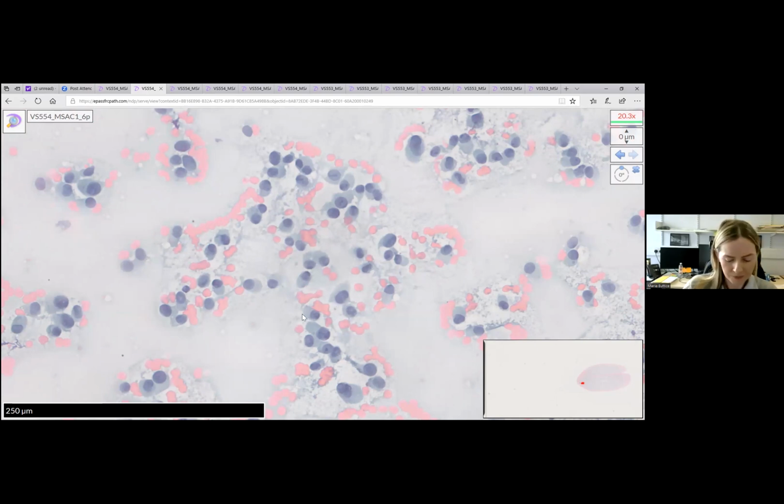Any questions? Thanks, Maria. I would just like to say that in this case, those of you who have gone straight for melanoma are probably going to get the best mark, because although melanoma can look like anything, this is what it most commonly looks like: a plasmacytoid, dispersed population of cells lacking any configuration in glandular structures.